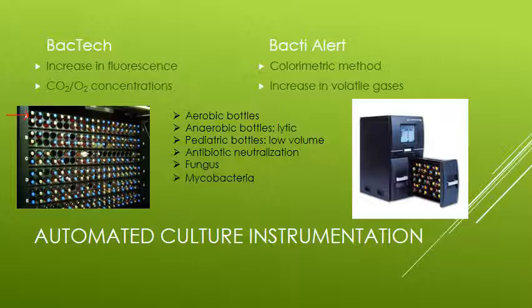And then as the bacteria grows, CO2 is released by the organism, which will interact with the dye in the base of the bottle, which will change the ability of that fluorescent material to absorb light. And what you have over time still has to be measured over time. The BacTec, the BacT/Alert, both of them take measurements approximately every 10 minutes. So over time, it'll take readings.